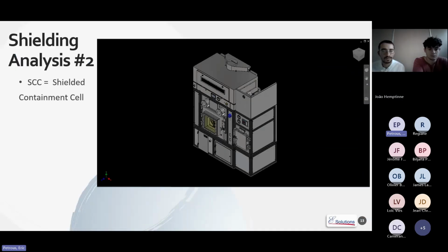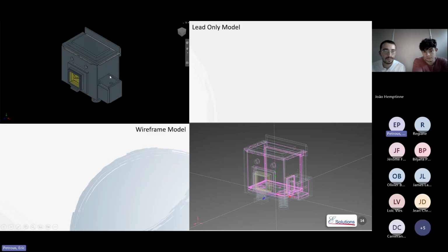So the first example I'm going to go over is an SCC, or shielded containment cell. So what you're seeing here is what we would actually model. For us, we use Inventor. And like he had mentioned earlier, you can import STEP files. So that's what we do. But first, we strip it down to a lead-only version. So it only has the lead, the leaded glass, and an inner cell. This gives us a most basic version, and it puts less strain on the simulation itself, not having all the structural materials in there. And then when we put it into RayXpert, you actually get this view down at the bottom right. I personally like to keep it in wireframe just so I can see everything that's going on inside.